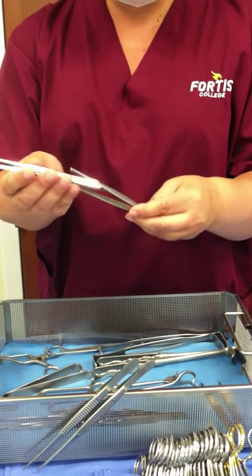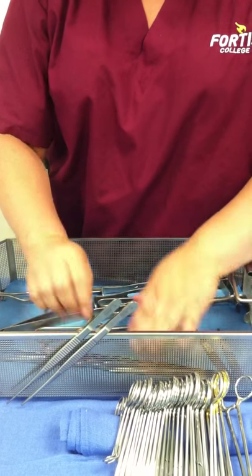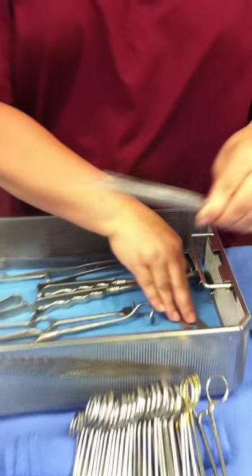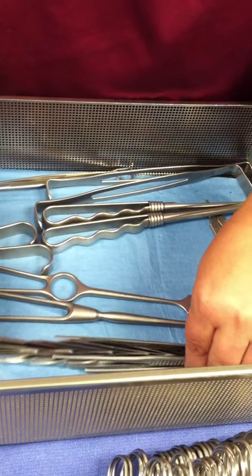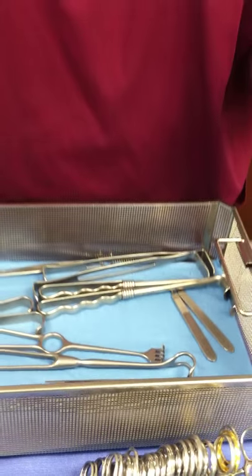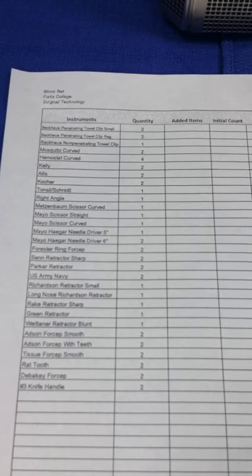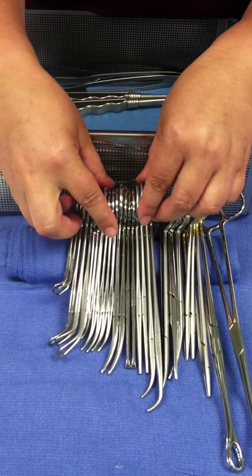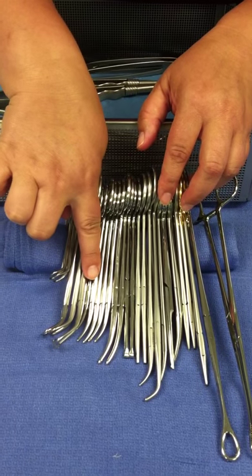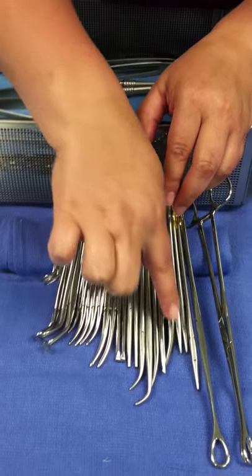Then we have our rat tooth, which is also going in the row nice and neatly. And then our debankies. Again, a nice organized tray helps to cut down on your time when setting up. As you can see, everything is listed here in order from the sheet. This way it is nice and easy for you to count your instruments. And if you notice, all of the curves are going the same way. This is also very important.